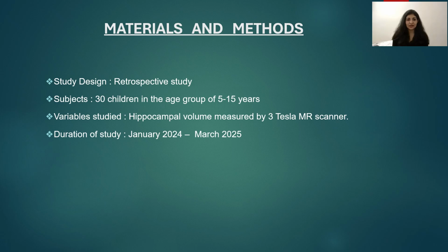It is a retrospective study. 30 children in the age group of 5 to 15 years were selected. Hippocampal volume measured by 3 Tesla MR scanner. The duration of the study was from January 2024 to March 2025.